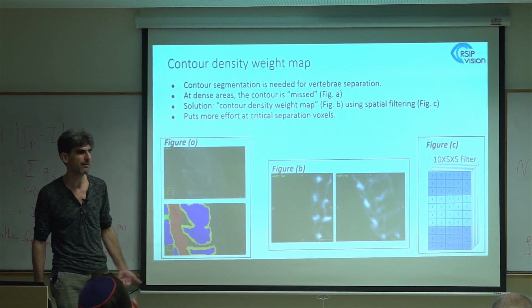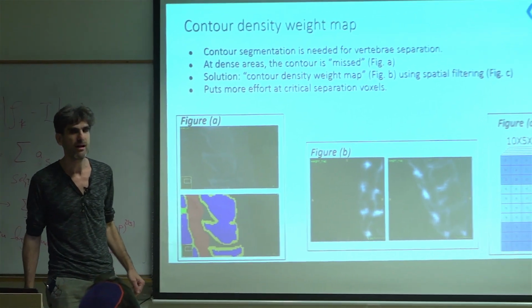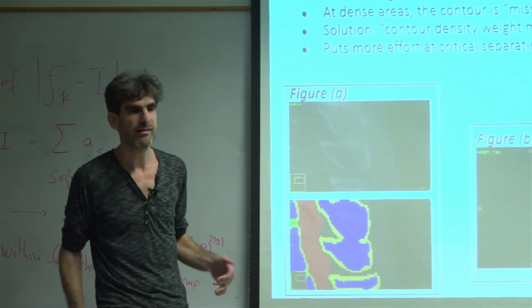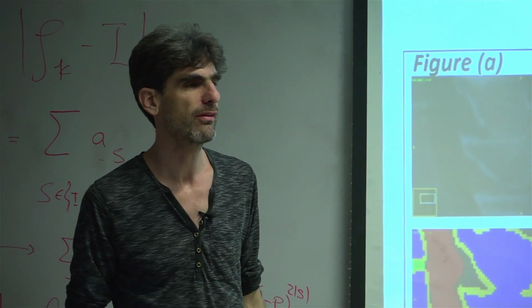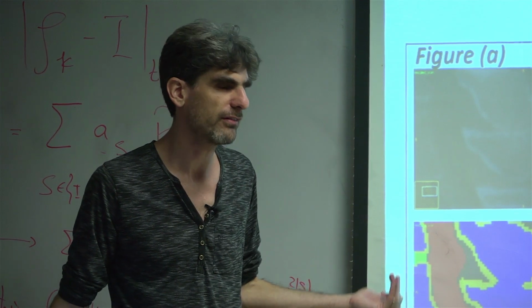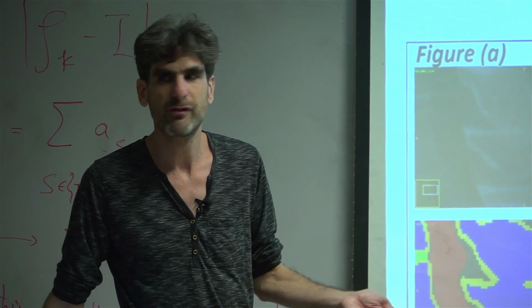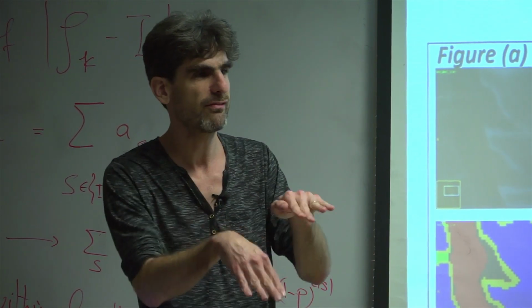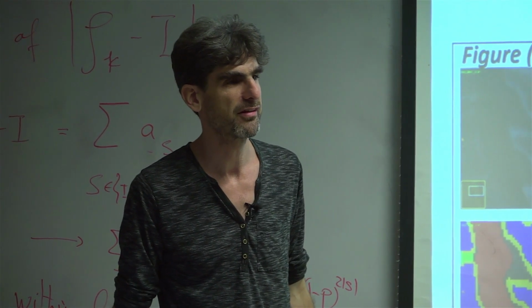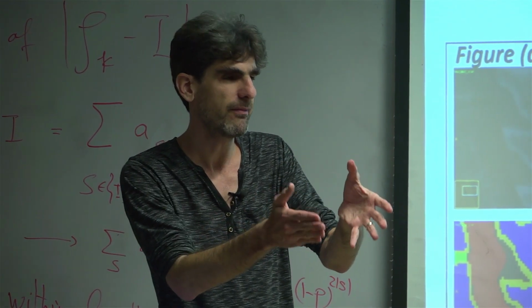That's sort of the idea of that bone boosting feature, that you boost the areas you think are bone a little bit. Yes. These architectures tend to have a more binary type of output. It depends what cost function you work with, but also for classification and also for segmentation. If you use a cost that's going to give you a sharp output, then typically it's not going to have very many intermediate values. I see. The edges will be pretty sharp. And also the edges in the image are pretty sharp.